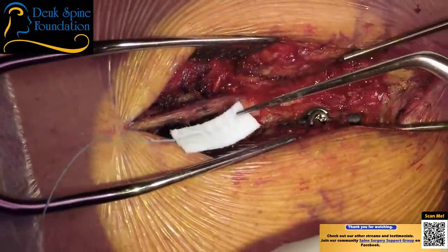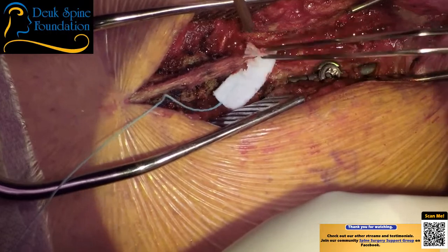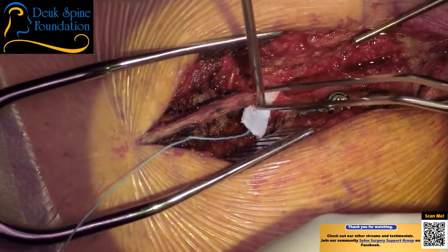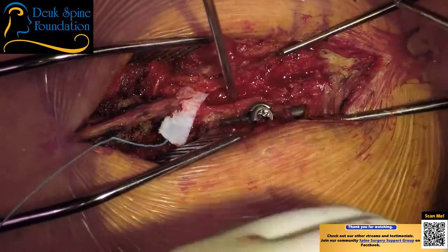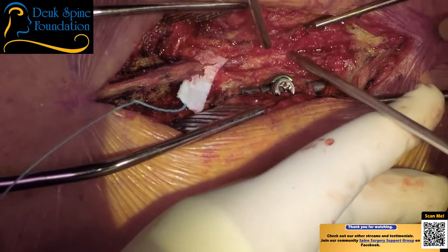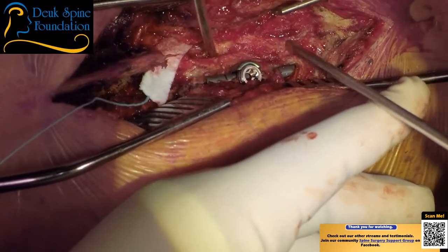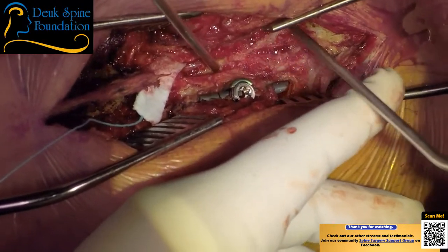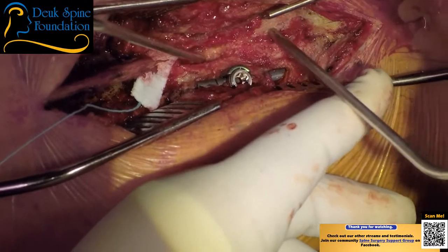When I do a fusion, I use screws and rods in this particular situation. We only use plates in the neck, gently, gently. Now there are some surgeons that use plates in the lumbar spine. I don't do that.